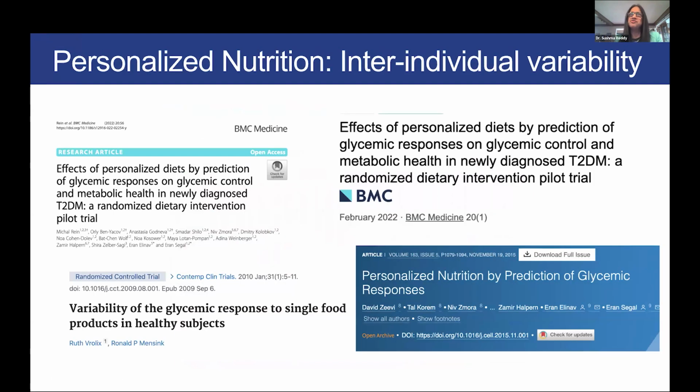And really, a couple things. First, finding out how different foods react to him, because we know now that one size does not fit all. Like I alluded to with my patient, everybody is different in how they respond to food. We know for a fact there's inter-individual variability. In the past, we kind of told all patients, can't eat this, can't eat that. That's not true. There's value to having them wear it, and then that real-time feedback changes behavior and also empowers the patient.